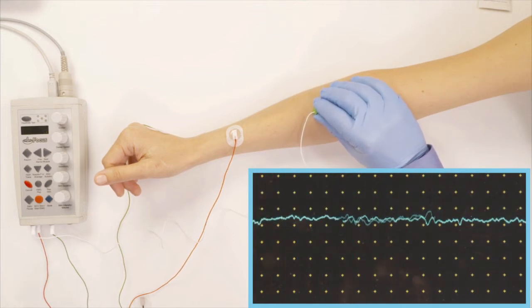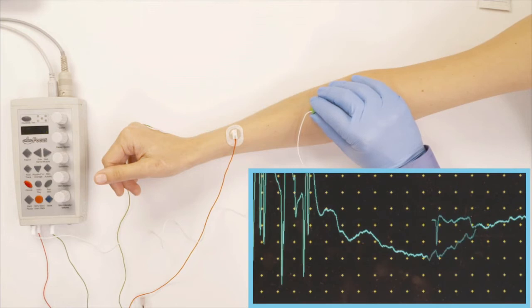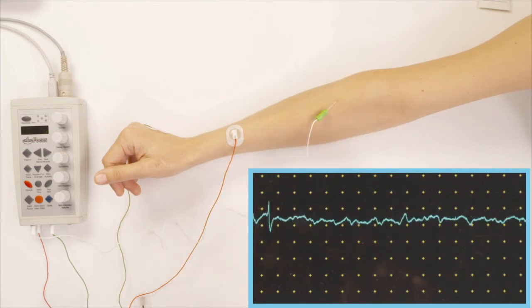As I insert, as soon as I stop, you really need to see it stop, essentially. And that's normal insertional activity.